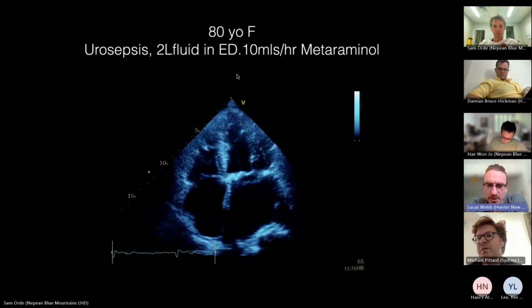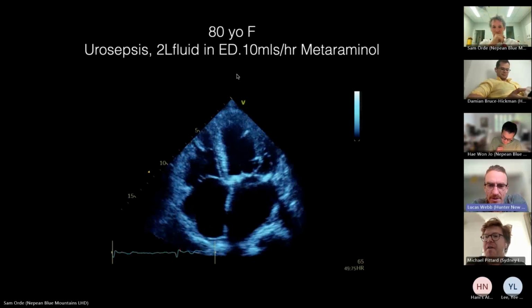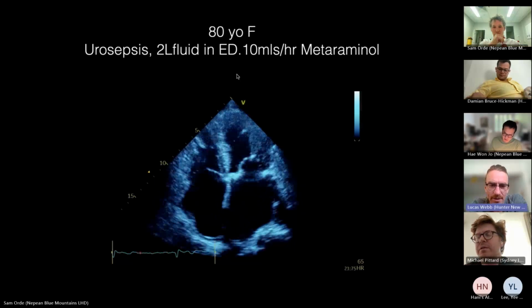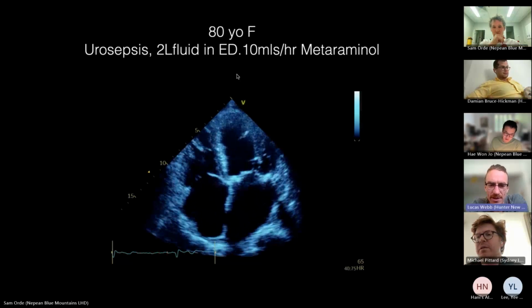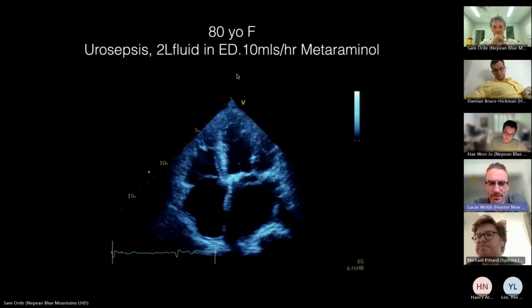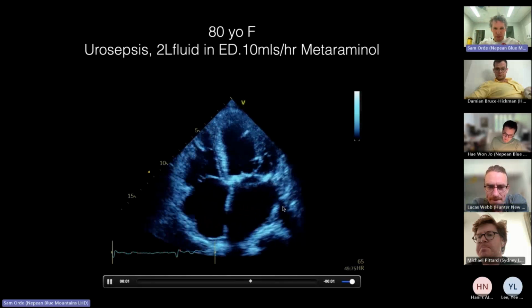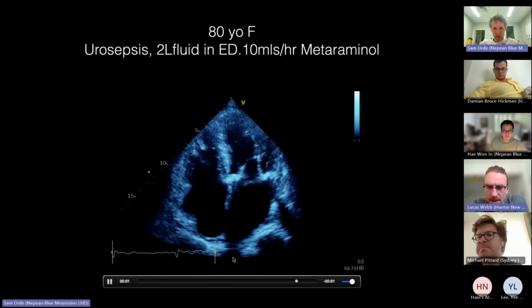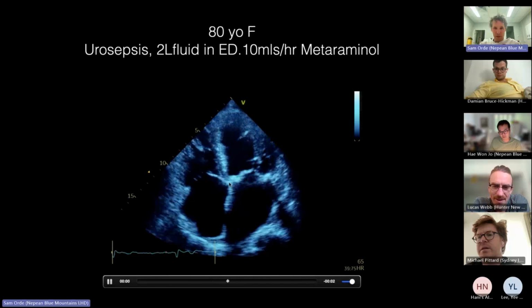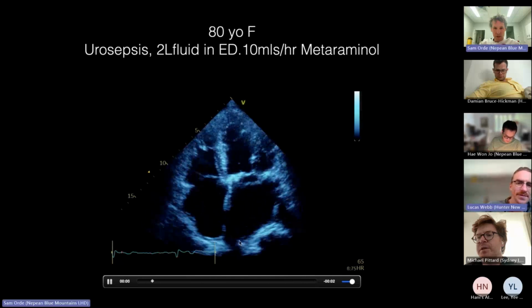So in terms of the left ventricle, I'm seeing concentric thickening throughout on this view. Again, the right ventricle, you'd want to measure the TAPSE whilst you're here, but it looks to be performing in keeping with the rest of the heart. The other thing, can you see at the back here, we've got these black lines? Yeah, pulmonary veins. Yeah, I don't think those are pulmonary veins, though. I reckon it's something to do with this stuff here. Can you see my cursor? Yeah, the calcification around the aortic valve.